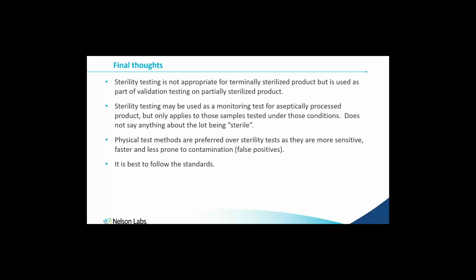There's times where people will say, well, I want to do this because I feel it's more conservative, or this is a worst case. Well, eventually you can make things such a worst case that you've made it basically impossible to pass. Or you've decided, oh, I'm going to do this because I feel it's more conservative, but now you've left the guidance and standards. So there's really no acceptance criteria or guidance on what to do if you fail. So the most conservative approach, follow the standards.